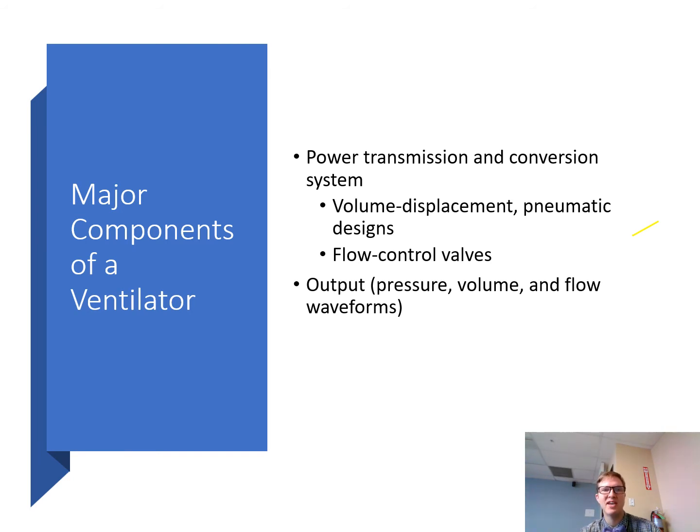So when we're looking at a particular valve, it usually produces a certain flow by controlling the opening and closing of the size of the orifice, right? So if we want a bigger flow, bigger orifice; smaller flow, smaller orifice, right? So the amount of flow varies depending on which valves are open as well. Like the infant Star ventilator uses this type of thing, so we can have very, very small flows for very small volumes and so forth.